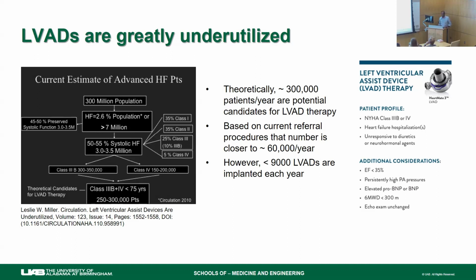One reason is that it's a very expensive device. It also requires major surgery. So not a lot of people have the insurance, and they don't want to go through the surgery. But there are also other important things. There are several factors that affect quality of life when you get these VADs.